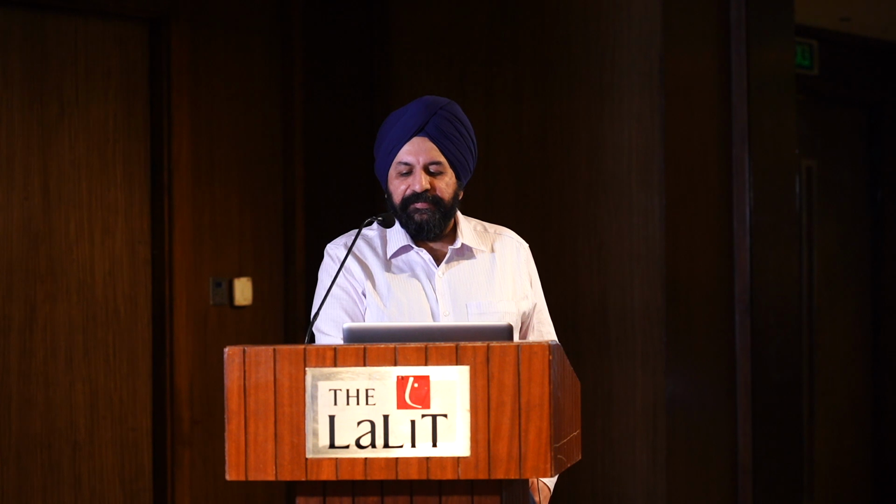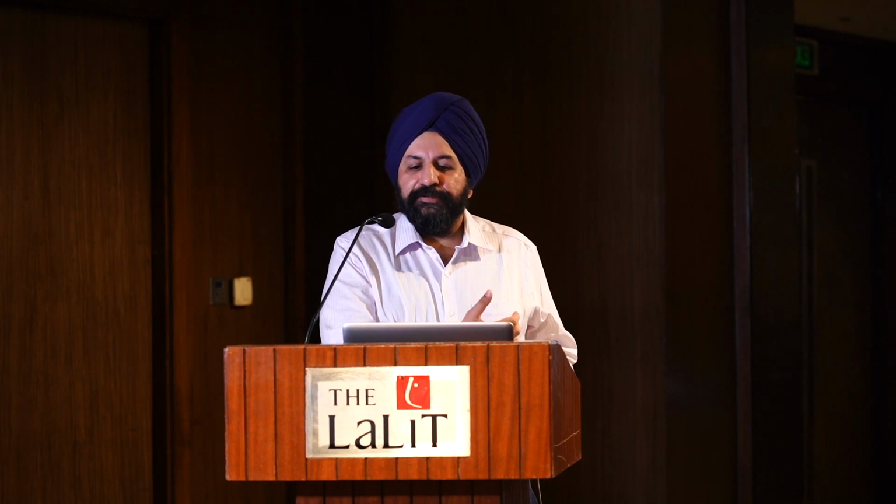Hemoglobin is only 9.4 to 9.5. But look at the jump of ret hemoglobin: from 23 it has jumped to 30.8. So whether your iron therapy is working or not, this is the earliest marker to look for response to treatment also.